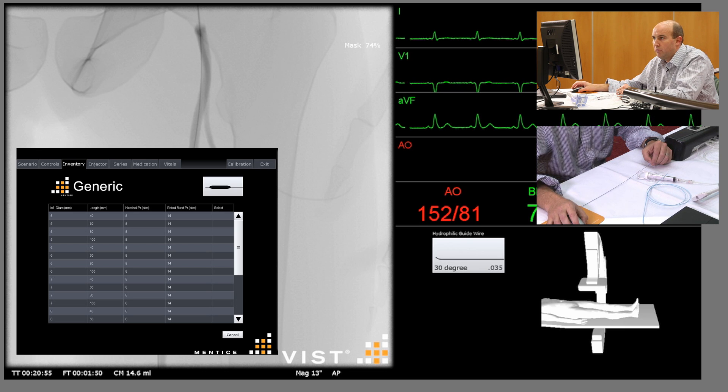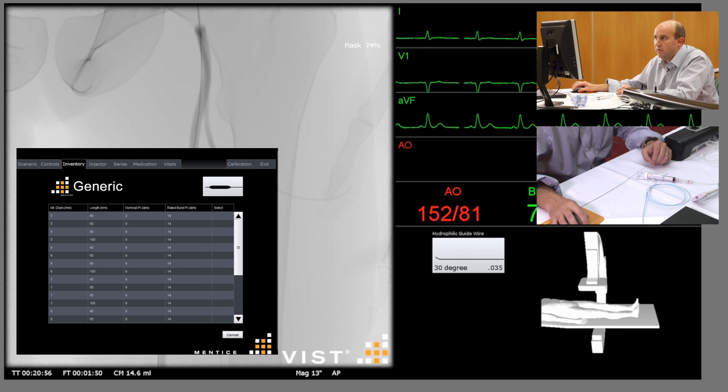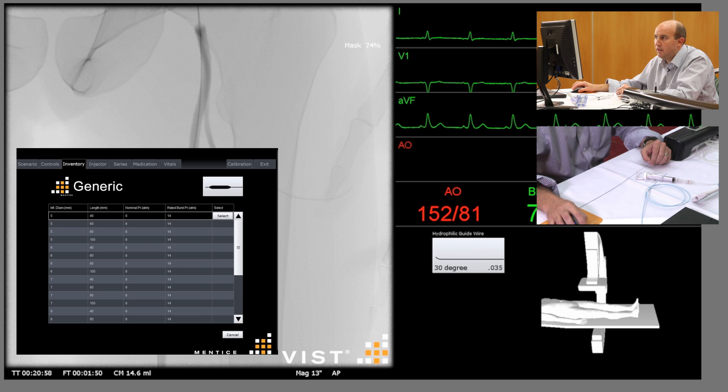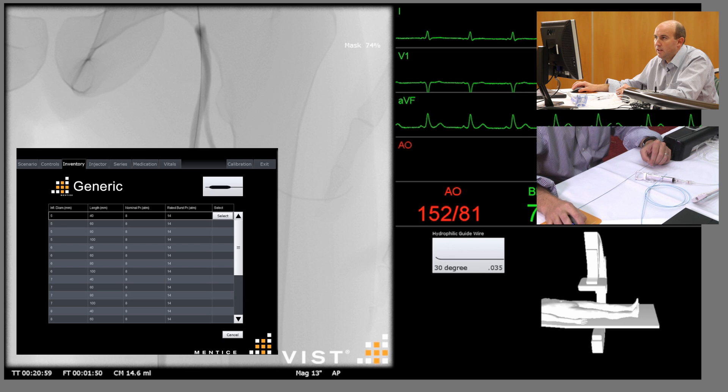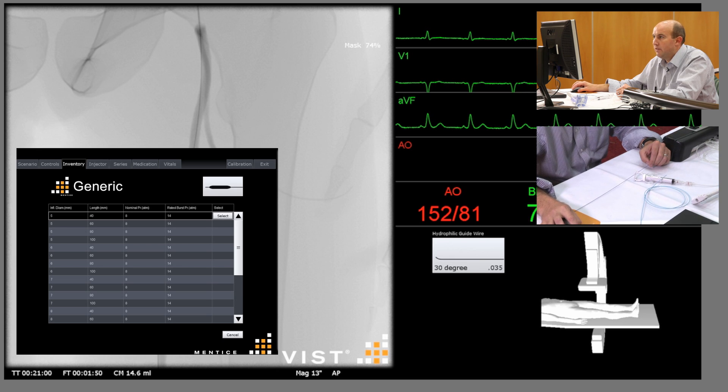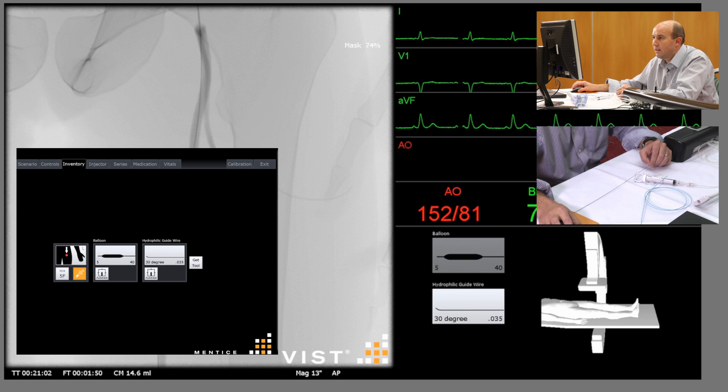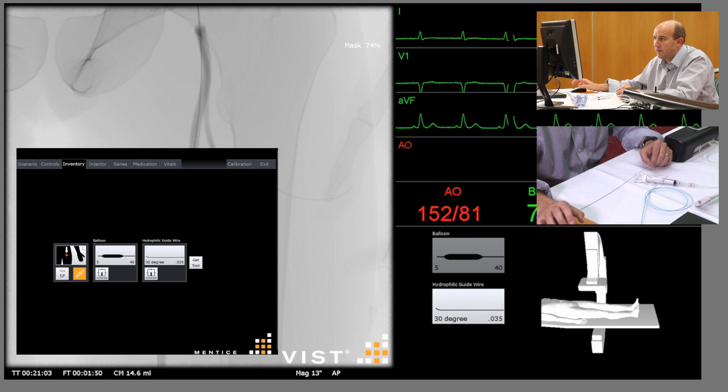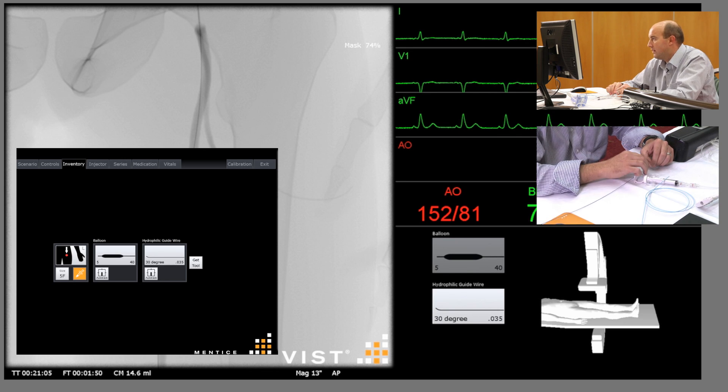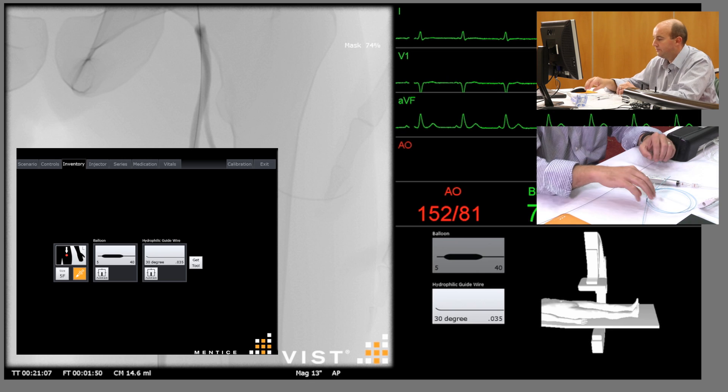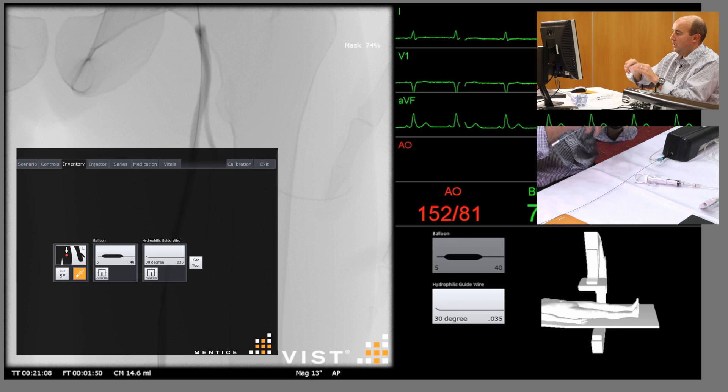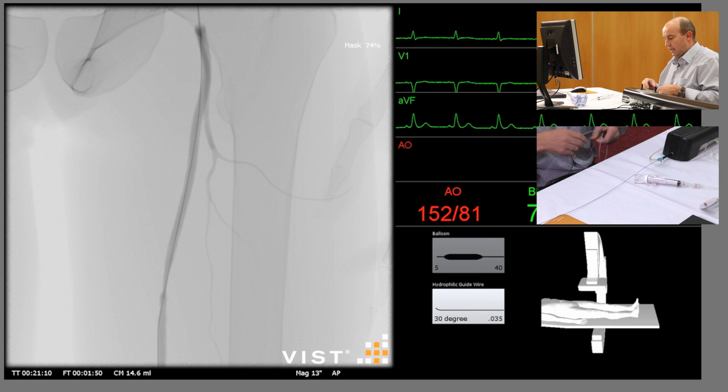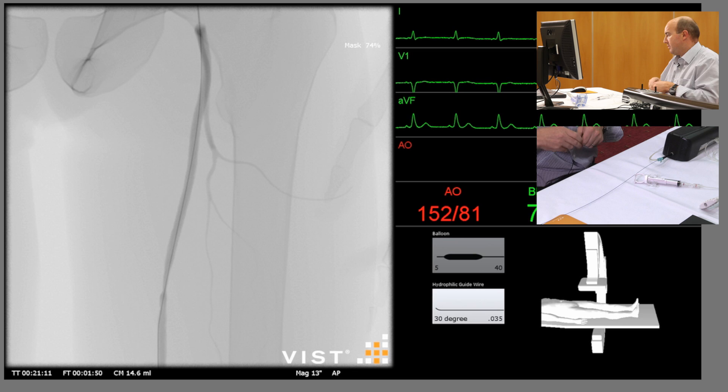That's pretty typical for an SFA. It's a short lesion, so the shortest balloon we can pick here is a 40 millimeter length. So we select that. You can see that's pre-selected and it features up on the right-hand screen also. So we take this catheter which will represent the balloon.